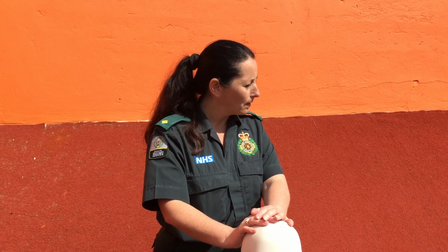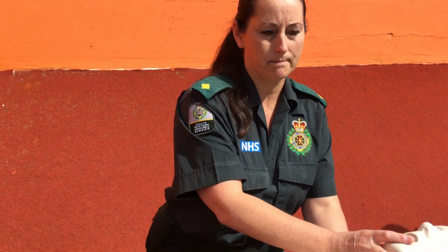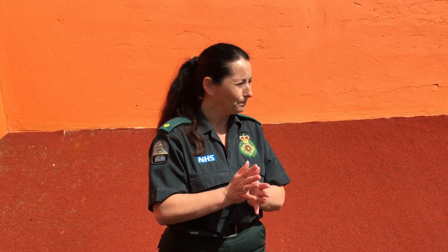So all you have to remember is your basic life support. Your doctor's ABC: danger, response, shout for help, airway, breathing. If they are breathing, you put them in the recovery position. If they're not breathing, you start your CPR till somebody comes back with that defib. As soon as they come back with that defib, if there's one available, you get those pads on that chest as soon as possible.